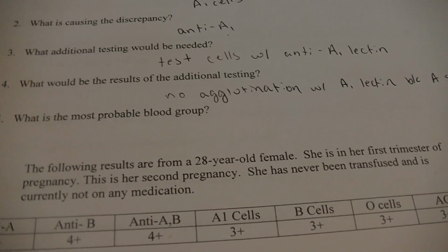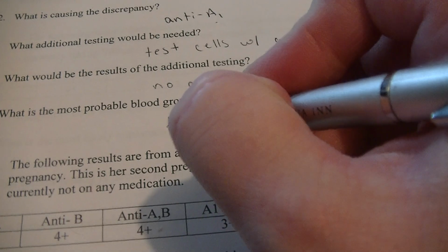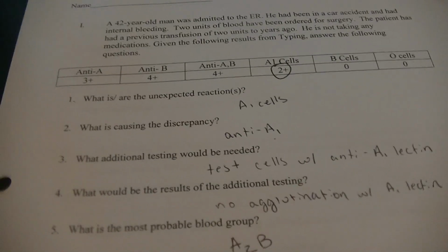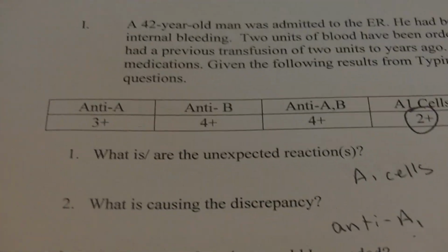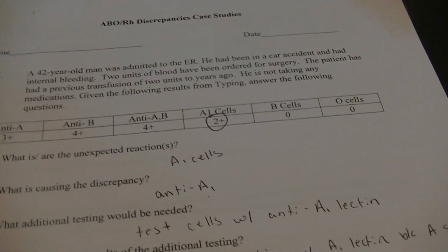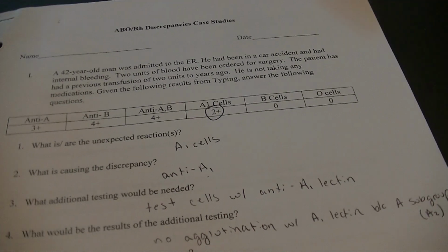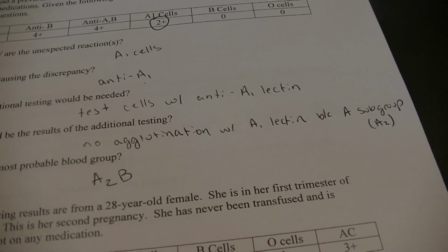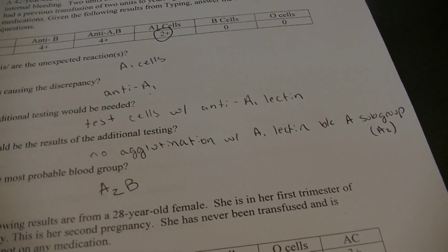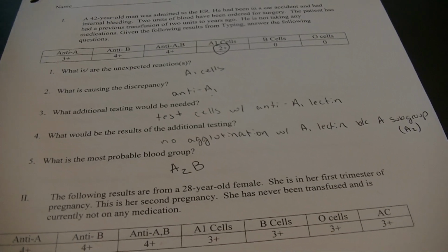So what is the most probable blood group for this person? A2B blood type, because we had a reaction with anti-B that we could trust, and we had a reaction with anti-A, and the person created an anti-A1, meaning they probably weren't A1, and testing with A1 lectin would confirm that they are not A1, so probably A2 because A2 is the most common subgroup of A.